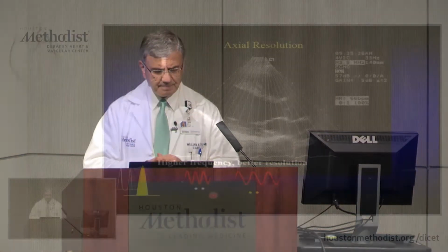You're not going to be able to tell these apart; they're going to look like a blob. And you can see that actually when you change the frequency on your transducer. Go to higher frequency, 3.5, 5 megahertz, 5.5, 6 megahertz. The image looks so refined, so fine, as opposed to more globular the lower the frequency you're dealing with. So I think these are important from an acquisition point of view, okay?